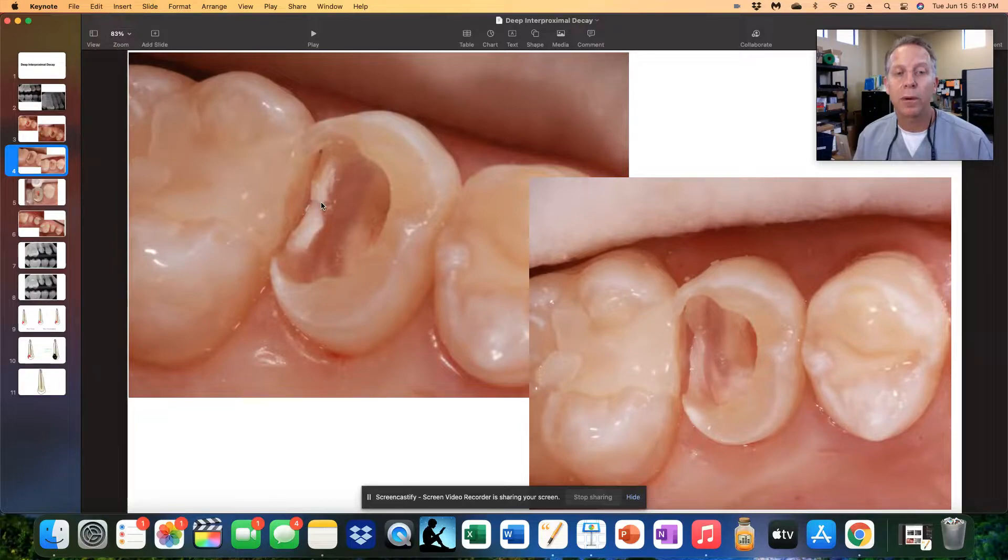When you get to this part of the tooth, be very delicate. Only go with very slight pressure with your slow speed so that you don't inadvertently or iatrogenically break off this piece of enamel, which is still quite useful. I got that whitish demineralized enamel out of the way, and this is what we wound up with — basically all of this good solid enamel right here. All this has been dug out deep inside where the pulp chamber was, and of course it expanded out, but I was able to keep this intact.